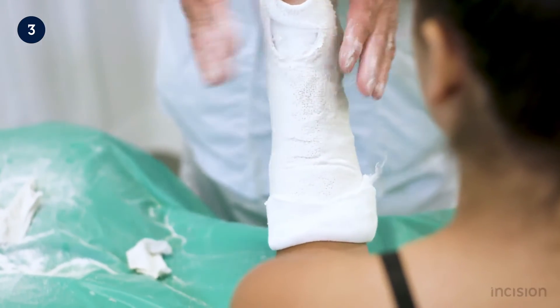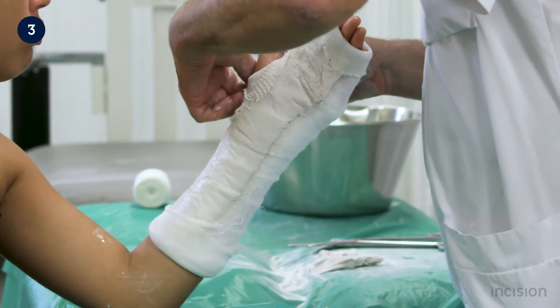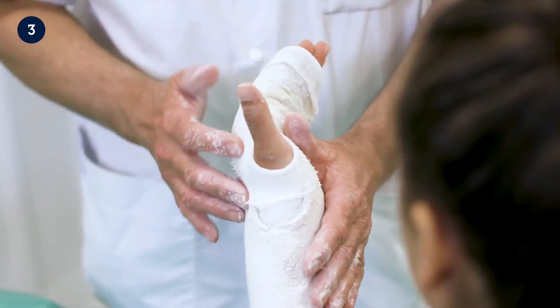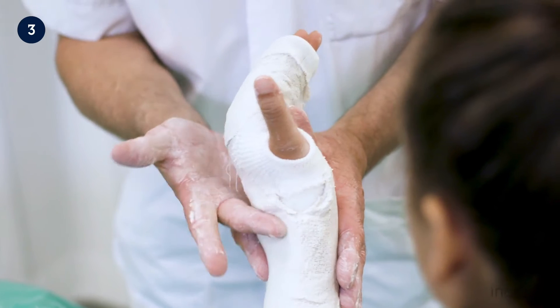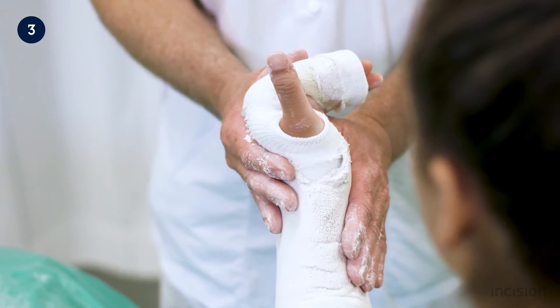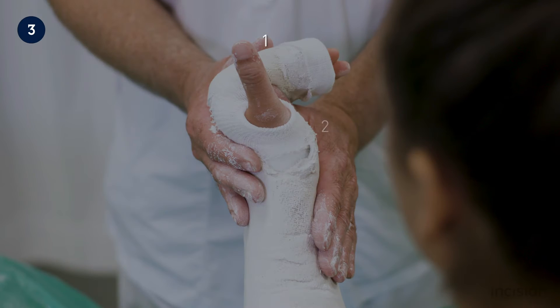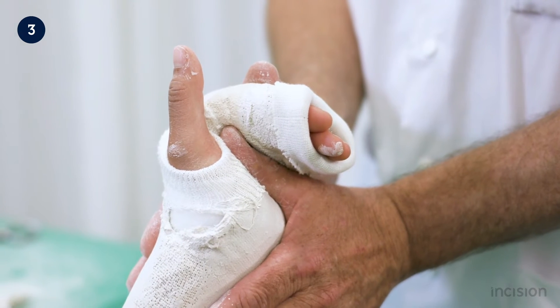The plaster is smoothed again to remove any wrinkles and to distribute the water evenly. Thereafter, the plaster is molded in the intrinsic plus position. To avoid pressure points, the flat parts of the hand are used rather than the fingertips. The cast technician places one thumb in the palm of the patient's hand while the other thumb and fingers support the fracture from the dorsal side, providing a one-two-three point fixation of the fracture. The plaster is supported in this position as it hardens.